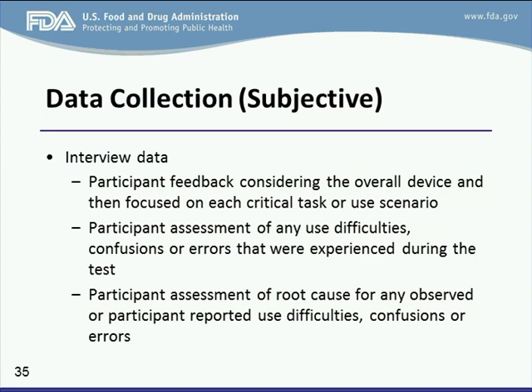You can also get the participant's assessment regarding their own thinking on what the use-related issues are, including use error, difficulty, and confusions that occurred during the human factors testing. Last but not least, you should get the participant's perspective on why those use-related issues occurred during the human factors testing, and that will be used for the root cause analysis for those usability issues.